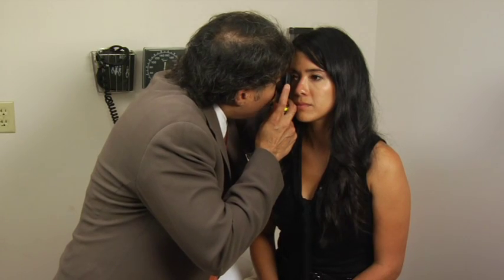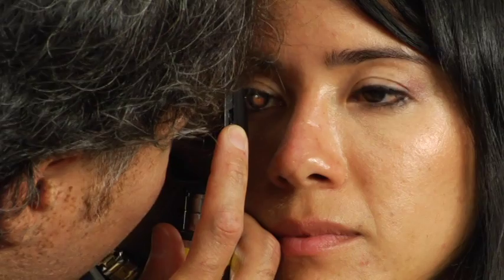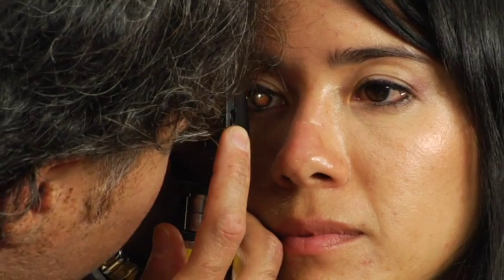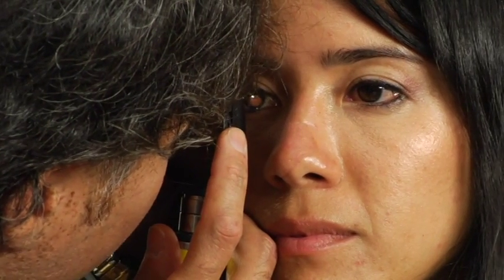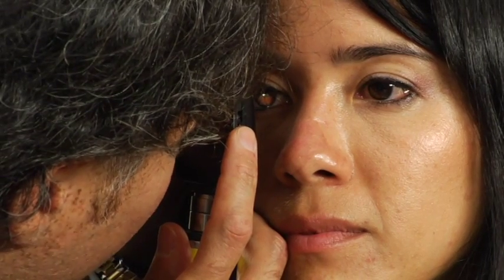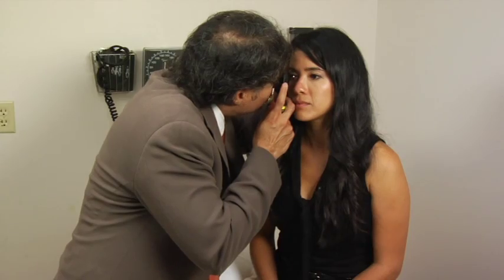I'm also looking at the margins of the optic nerve. They should be clean and distinct. If they're indistinct or blurred, that could be evidence of optic nerve edema, possibly papilledema. I'll also be looking at the cup, the center portion of the optic nerve. And normally the cup to disc ratio, the disc being the complete optic nerve head, should be about a 0.3. If it's any larger than that, that might indicate glaucoma.